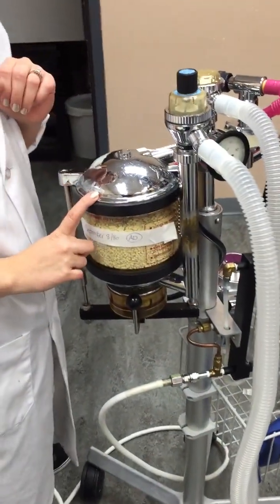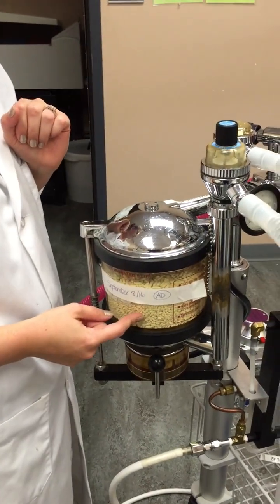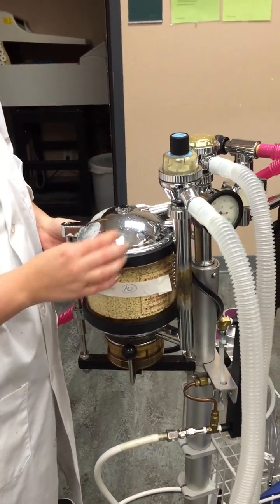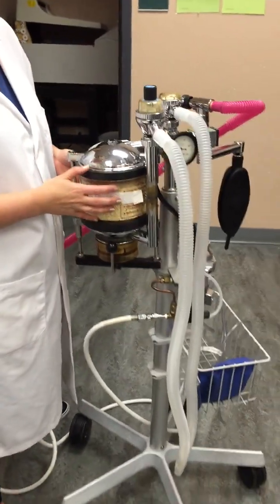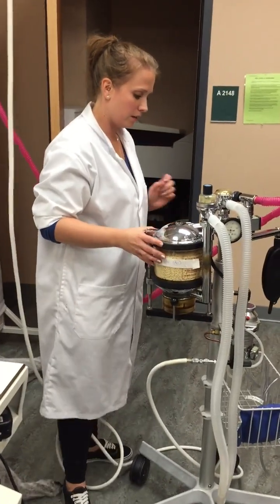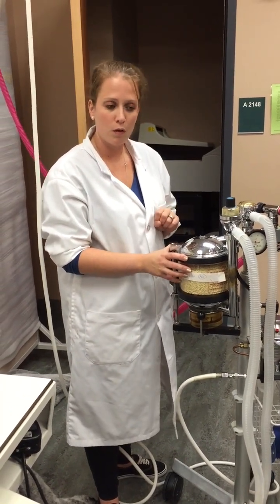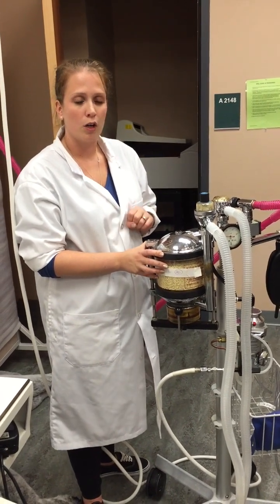And that's why it's very important to always know if your CO2 canister is exhausted or not, because if it is exhausted, it will not absorb the end tidal CO2 and your patient will rebreathe the carbon dioxide, which you do not want and can be detrimental to your patient. That is it for a rebreathing O2 flow system, and next will be the non-rebreathing system.